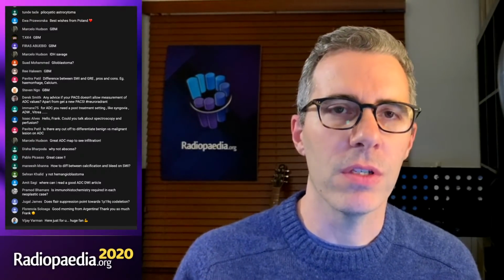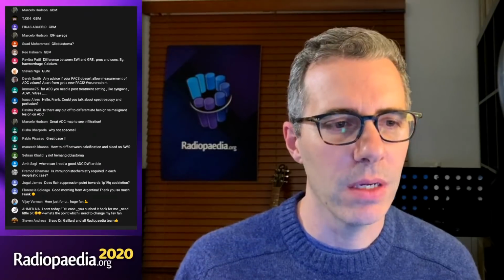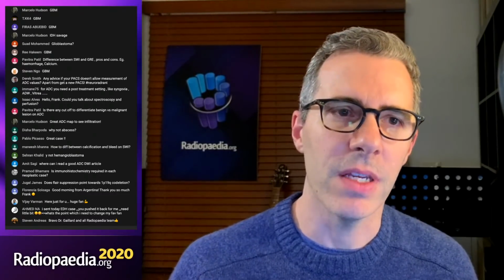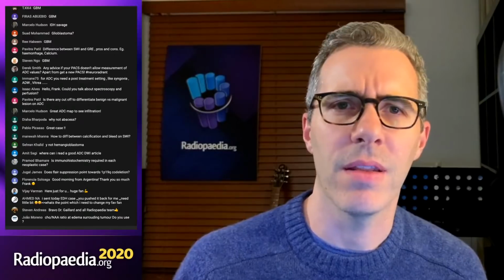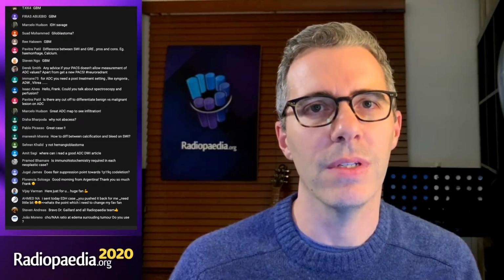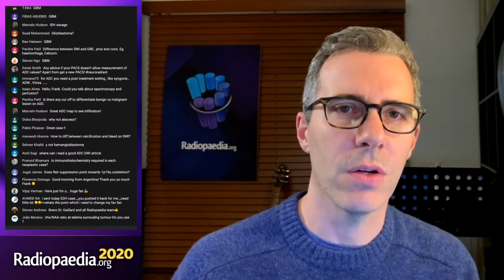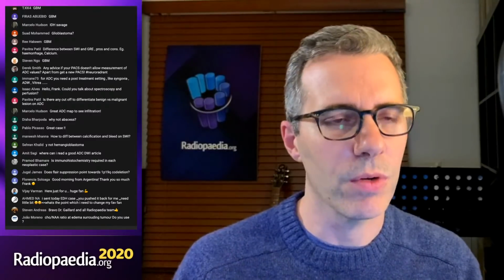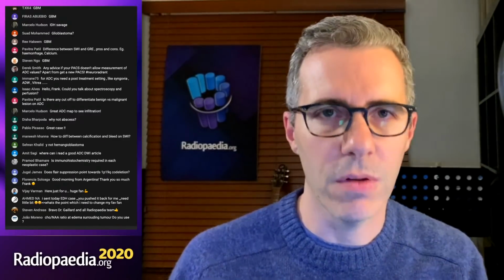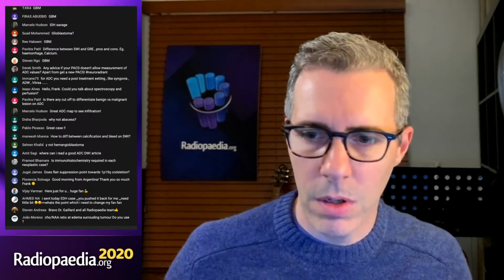I'm a great proponent of the use of ADC as an additional sequence and an additional data point to help you understand what's going on. And the pushback that I get most by critics of this is that the numbers aren't that good. And it's true. They're not magical single values that let you definitely differentiate things. But they are helpful in giving you a sense of the kind of histology that you're looking at. And when you combine that with morphology and demographics and other sequences, it's very, very helpful. As a general rule, having said all of that, and with a great deal of overlap, let me see if I'll actually draw this.